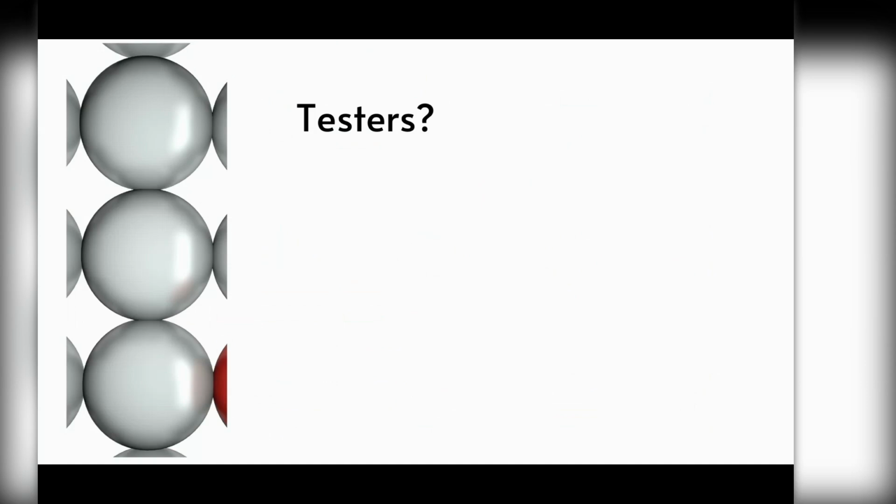So one of the things when you read all of the different papers in here is look at who's using it. Is it the lab people or the end users? Again, what is the sample type? We highlighted that there are 2 different sample types in ours, but for others, we've got to look and say, do matrix studies demonstrate similar performance between plasma and whole blood, for example? Do they need to be repeated in fresh whole blood collections for point of care studies? This is one of the things that we need to do to really progress this area.